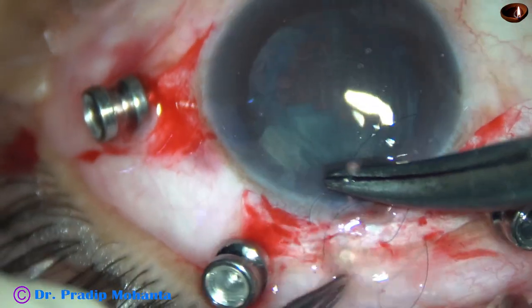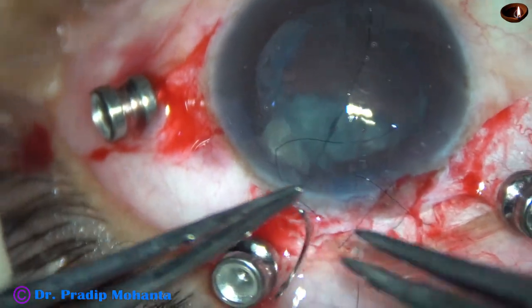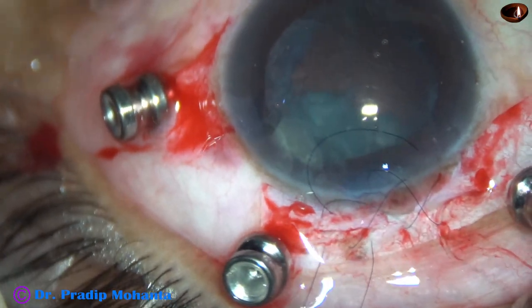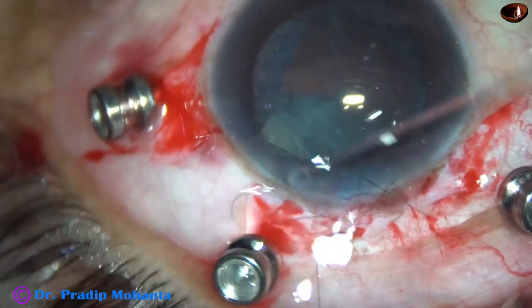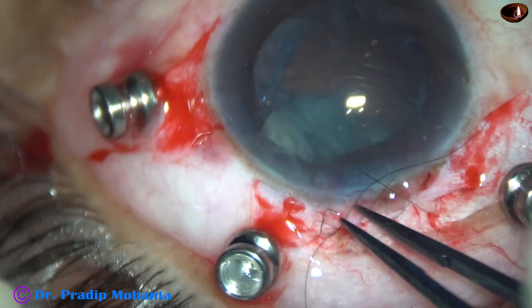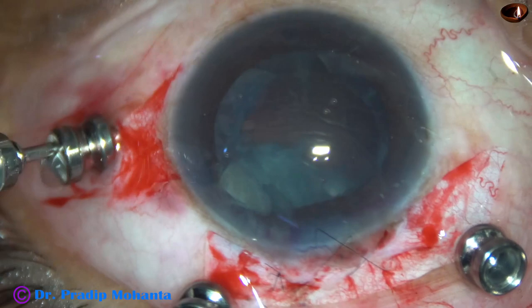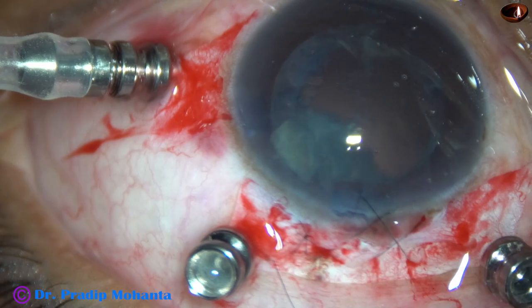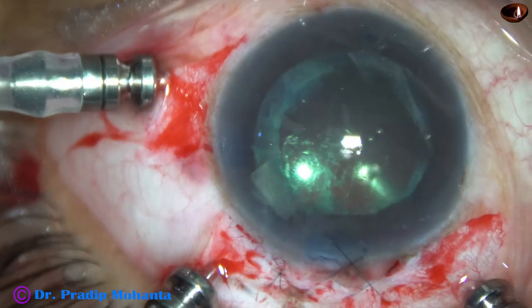Why do I need to do this? Because I need a closed chamber. I am going to use an irrigating contact lens over the cornea to see the retina and lens matter. So the main wound is closed, and I put the irrigation on and start vitrectomy.